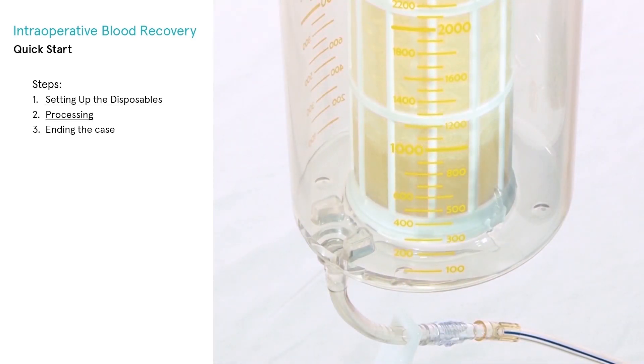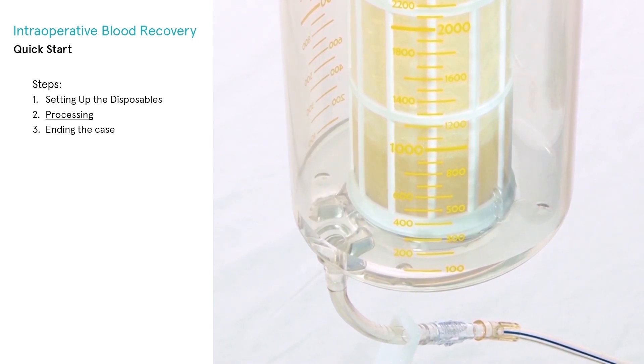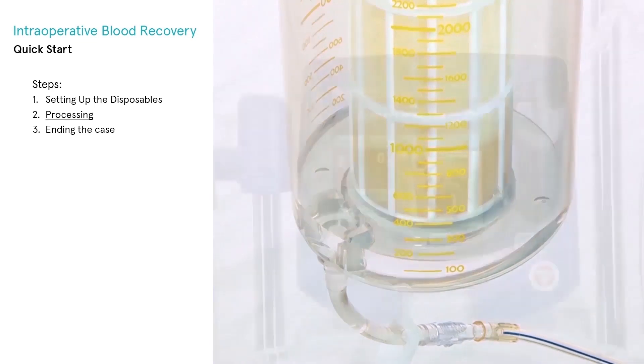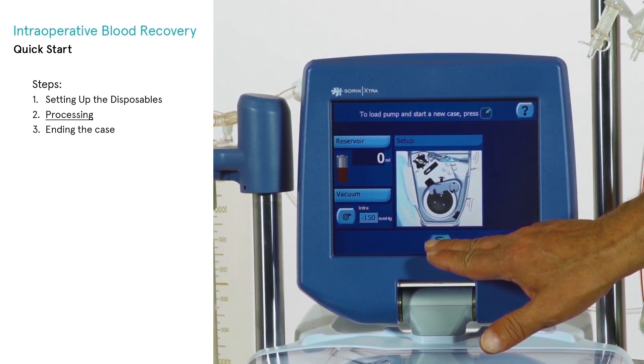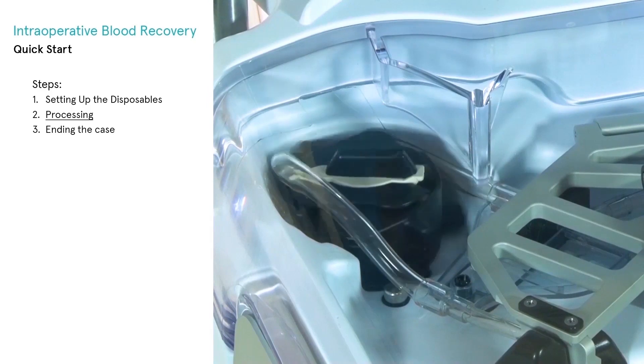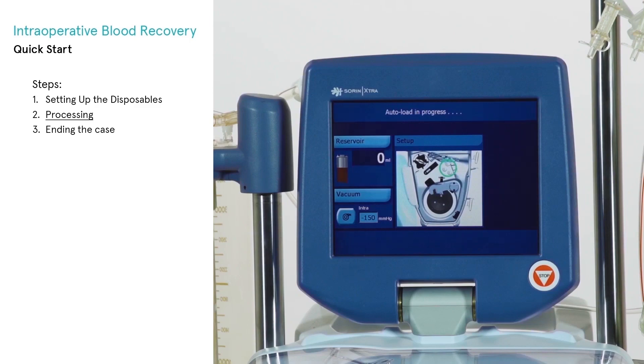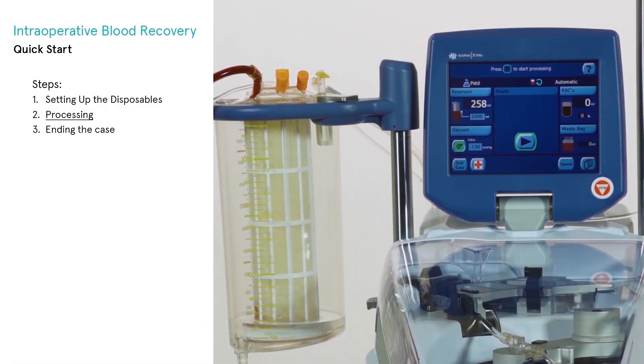With the X-VAC system on, open the roller clamp fully and allow a minimum of 200 milliliters of anticoagulant solution to be drawn into the blood collection reservoir. Touch the load button to automatically load the pump loop. The system performs a series of checks during the autoload procedure. If auto-start is active, then it is not necessary to touch the play button.